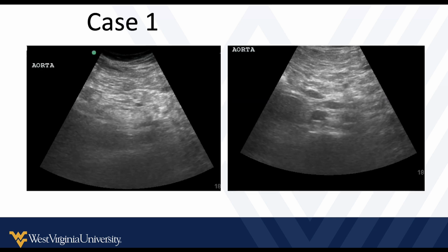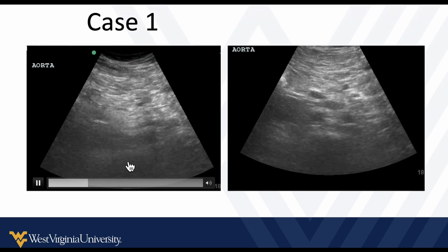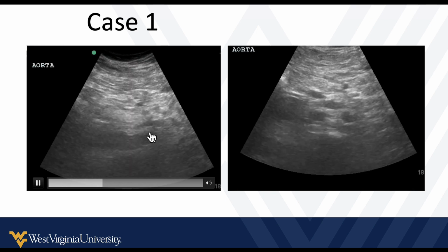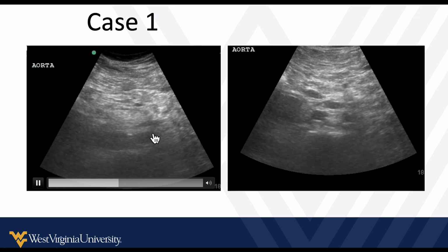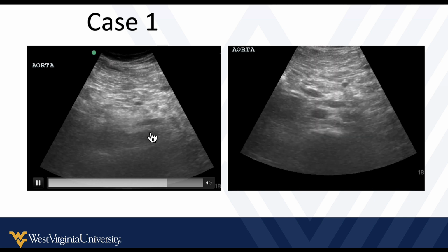So in this case, we get some bedside ultrasound pictures, and you'll see sometimes the pictures aren't beautiful. That's real life and how that happens. But we can still recognize here is the shadow from the vertebral body, and sitting on top here is the abdominal aorta. Now, even though this isn't the clearest, best picture on earth, we can answer the question, is it too big or not? In this case, this is not an enlarged aorta, so that answers that question.